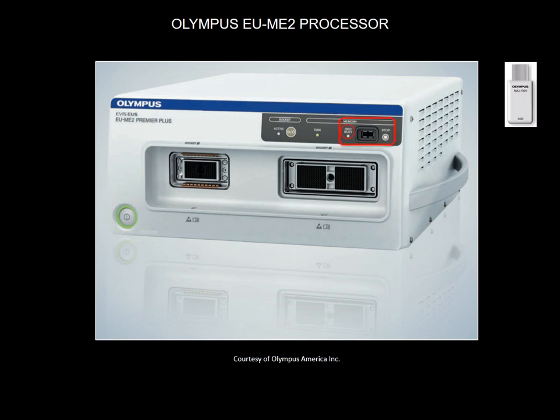If you are planning to save your exam on a USB drive, insert it in the USB port located on the front. Ensure the portable memory access indicator is lit. It is green when the device is ready. It blinks orange when the processor is accessing memory.